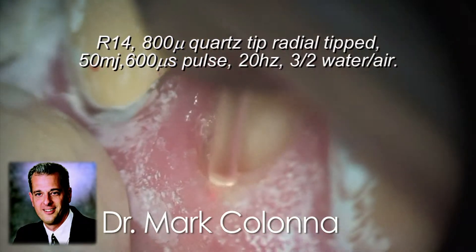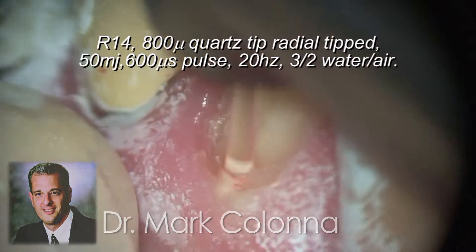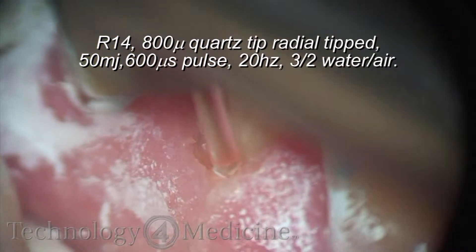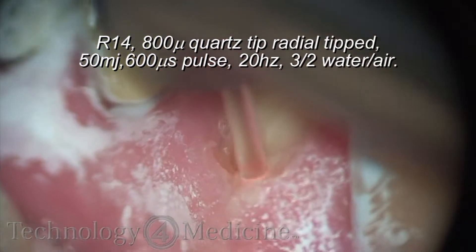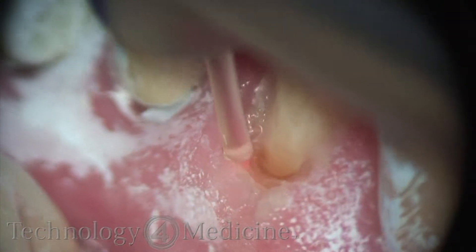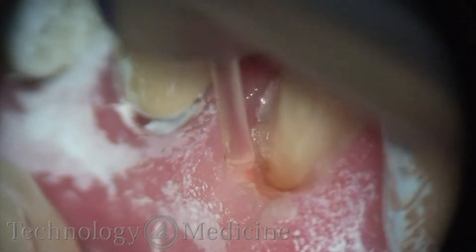One of the other functions of the Erbium laser is utilizing the tipped handpiece, or the R14 handpiece. You can do all sorts of other types of operations. In this case, you can see in contact, I'm actually creating a trough around a crown margin.